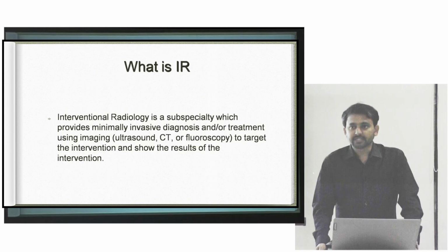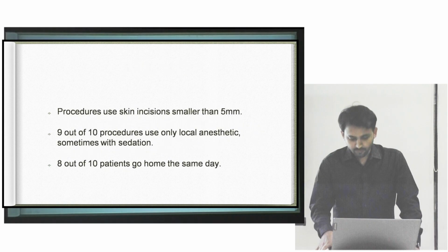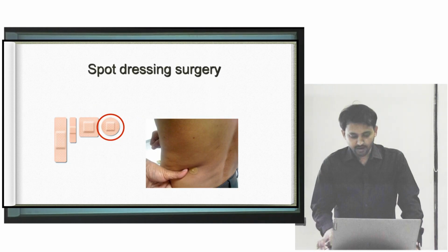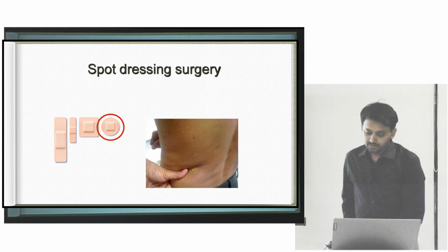Basically, IR is interventional radiology. IR is a subspecialty where we use image guidance, either CT or ultrasound or fluoroscopy, to deal with diagnosis or treatment. Most of our IR procedures are daycare procedures, and we do them under local anesthesia, and most of the time the skin incision size will be very small, almost this is the size of the incision we give.